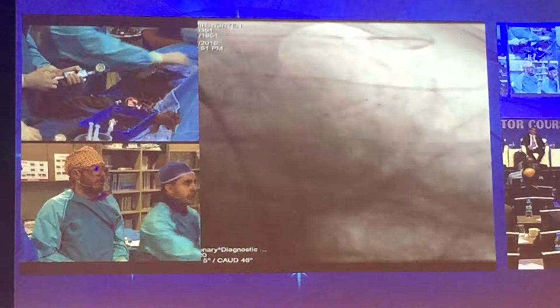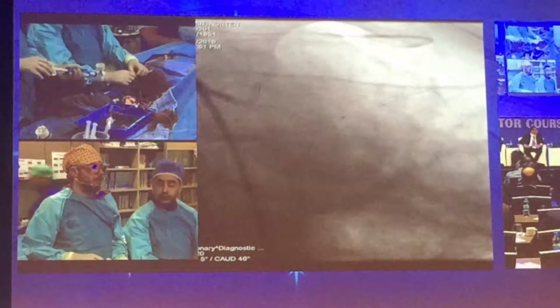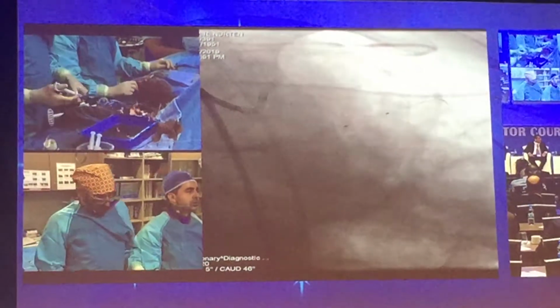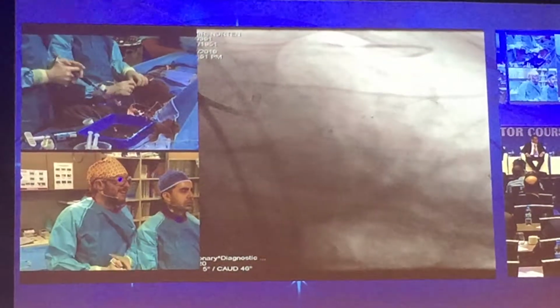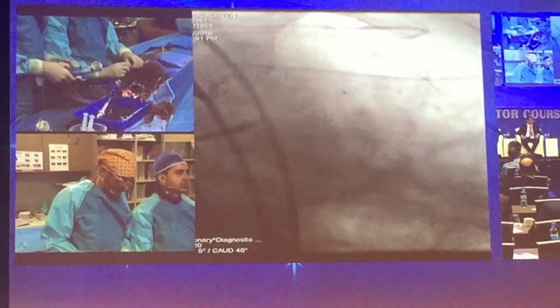Okay. Şunu çekelim artık. At this point, this is an instant stenosis, and antegrade please. Antegrade kontrast. The reason for stenosis is, as you mentioned, might be an undersizing of the stent or under expansion of the stent. What do you offer after this ballooning?